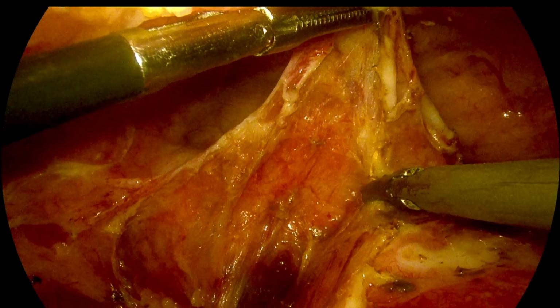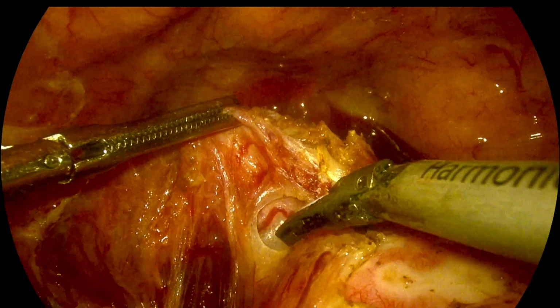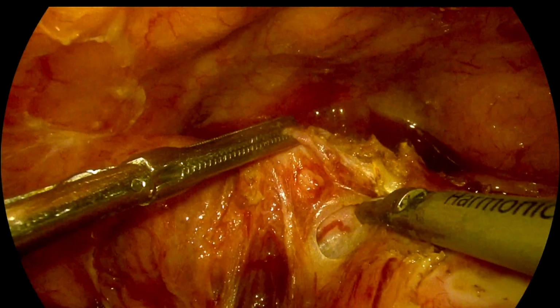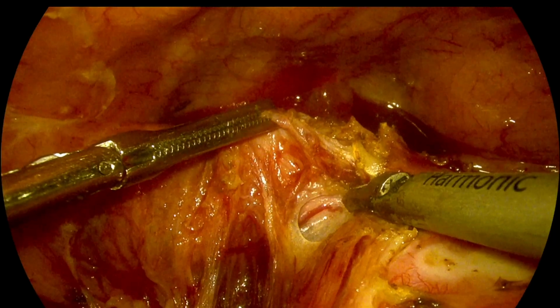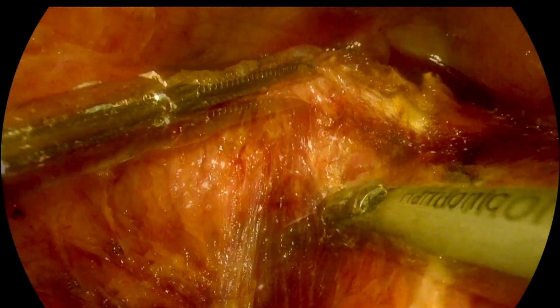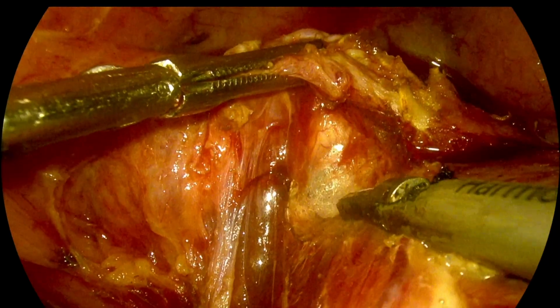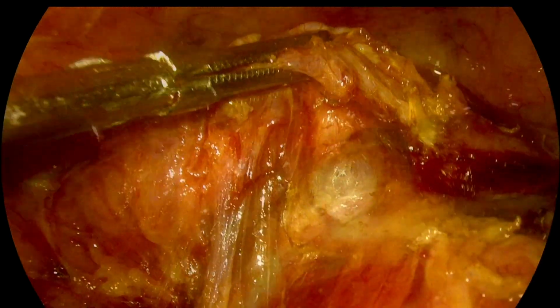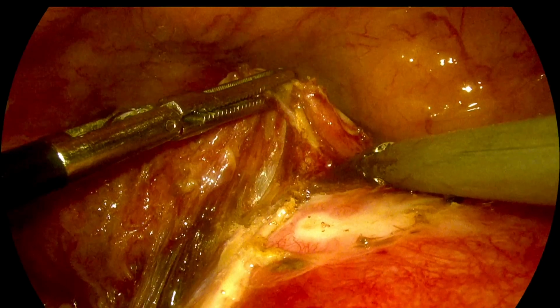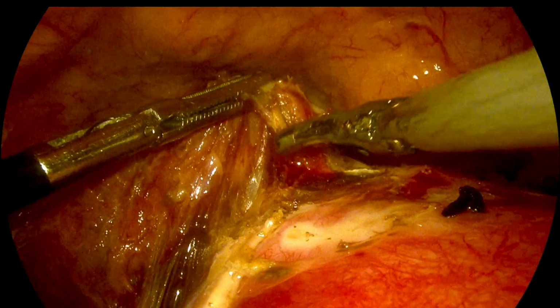So normally once you divide the uterovesical fold of peritoneum, the rest of the separation is easier. But here it is fibrotic and adhered. So without division, the tissue is not separating. Instead of doing a blunt dissection, it's better to go for a sharp dissection, identifying the avascular plane and then dividing the fibrotic band between the bladder and the cervix.